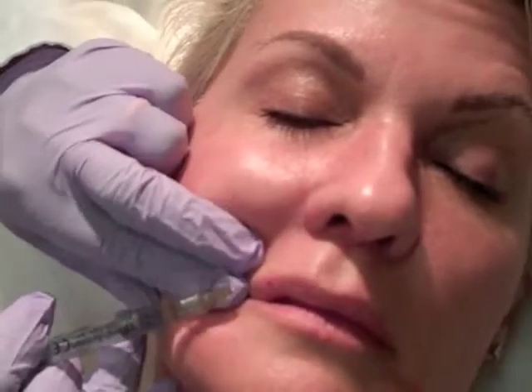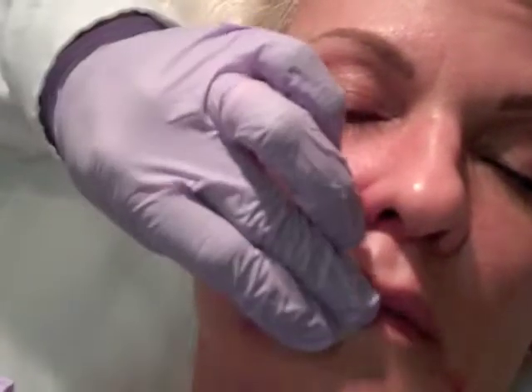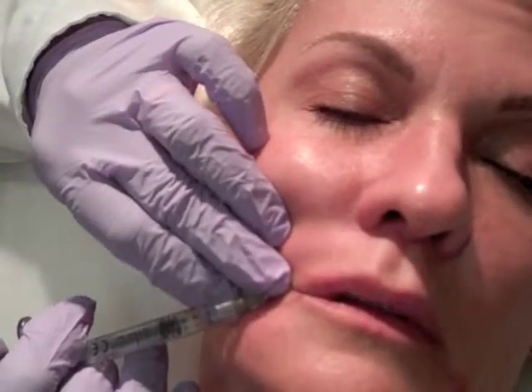It's a very straightforward filler. You note the vermilion line here which is along here, and it's an antegrade injection as I insert my needle into the lip area. A very, very small amount of filler needs to go in there. It bleeds a little bit but that bleeding will stop pretty quickly — the lip is a very vascular area as you know.